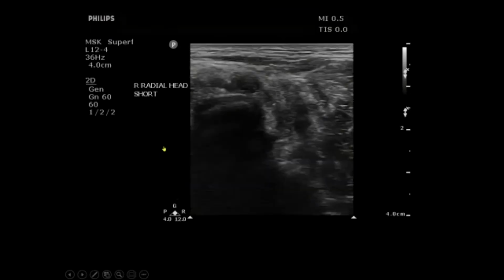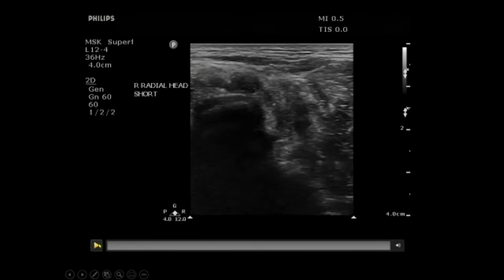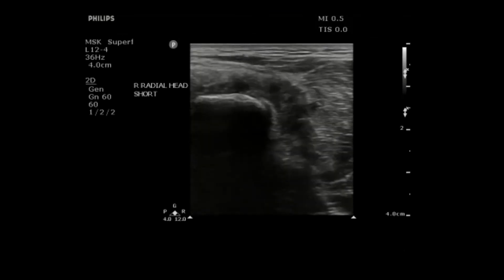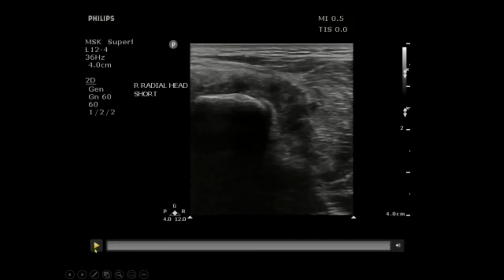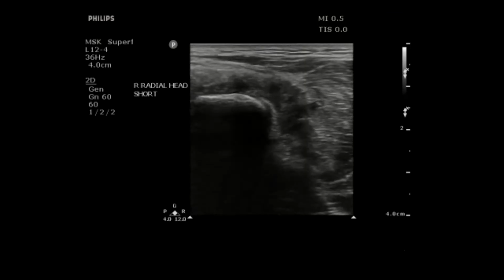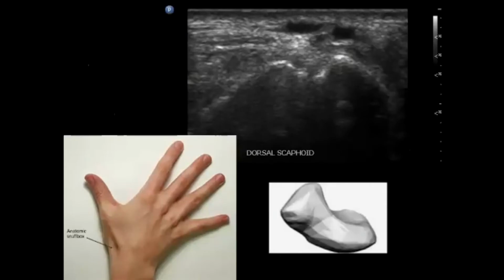And when you look in the short axis view or the sagittal view, you can see how the cortex is nice and flat. And then right at the beginning of this video, it's very irregular, and you can actually see a hematoma there. So there's a small fracture at the radial head. So this was actually diagnosed with ultrasound and not X-ray. So this would be something that you could definitely tell the patient, that they do have a small fracture, even though it wasn't seen on the X-ray. And I would be pretty comfortable doing that, and I think I did.